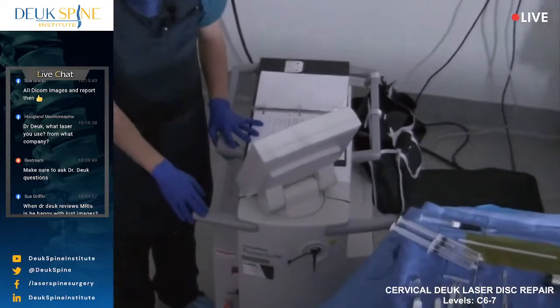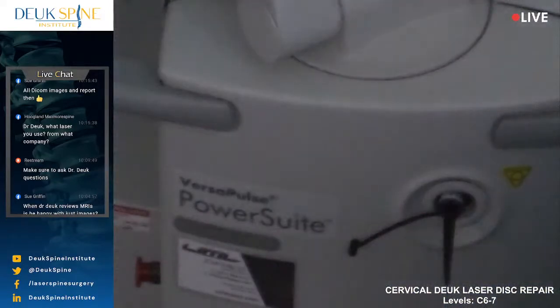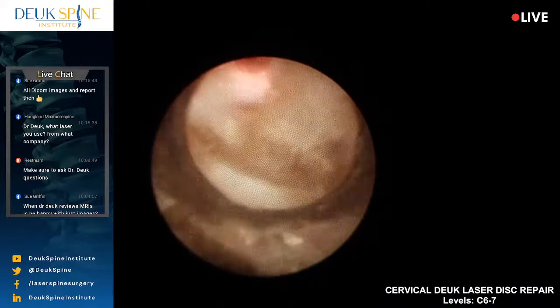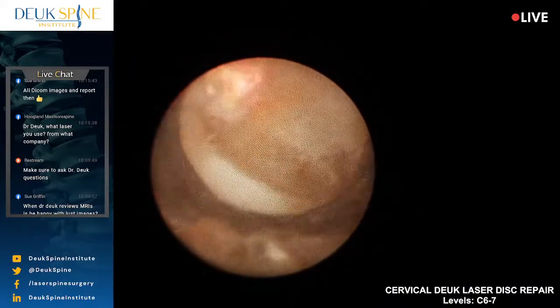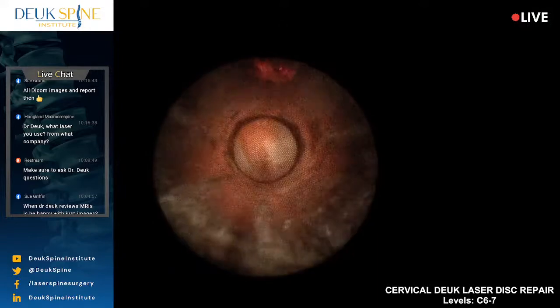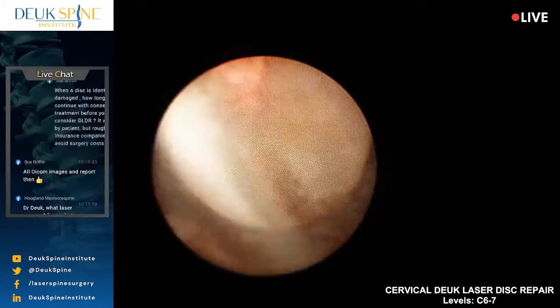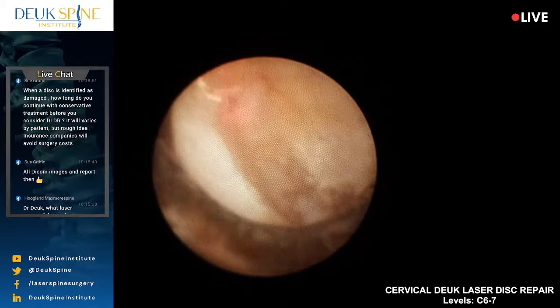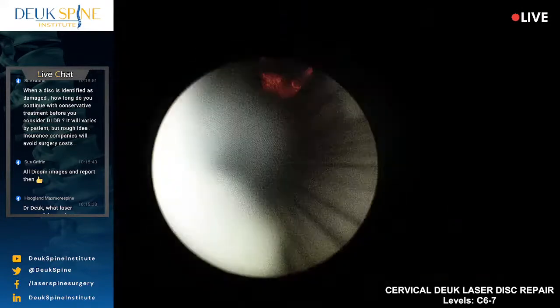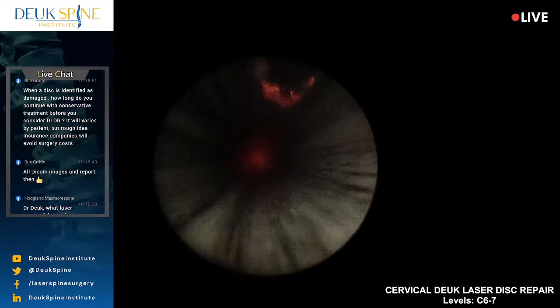A lot of this herniation is so bad. Tons of scar tissue right here that I'm dealing with, and this is all from the herniation itself. Herniations cause scar tissue because they cause inflammation. Inflammation produces scar tissue. That's where scar tissue comes from. Most people don't know that. It comes from inflammation. So that's where people get all this scar tissue. And oh, look at that herniation that just came out. That's awesome.